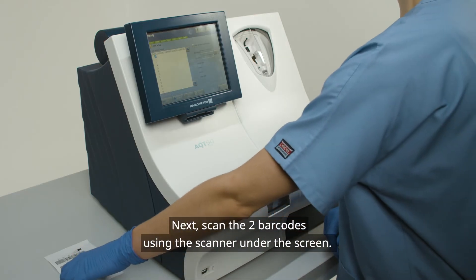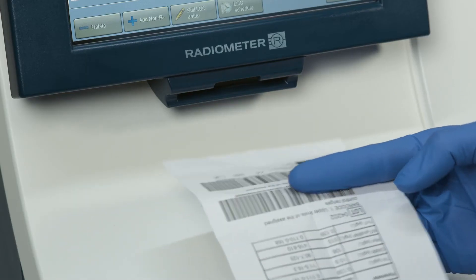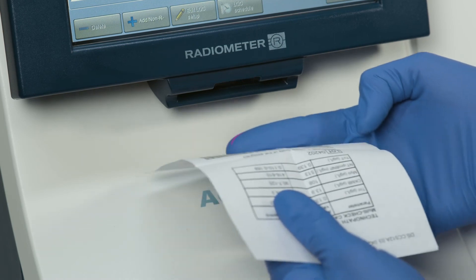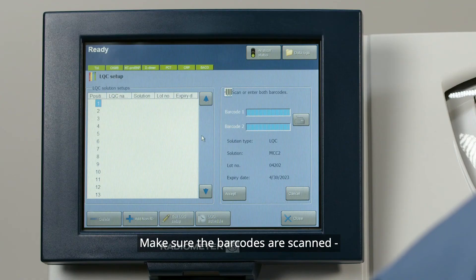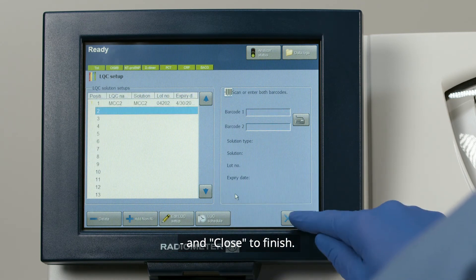Next, scan the two barcodes using the scanner under the screen. Make sure the barcodes are scanned, and then press Accept and Close to finish.